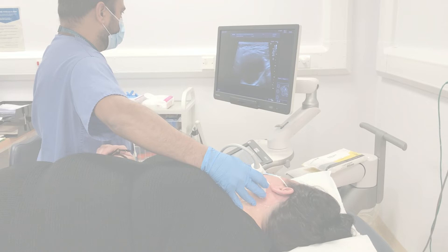If you are referred into our head and neck clinic with a neck lump, it is likely that your doctor will organise an ultrasound scan. This can often happen on the day, but occasionally is arranged for a later date. The purpose of this video is to show you what happens during the scan.